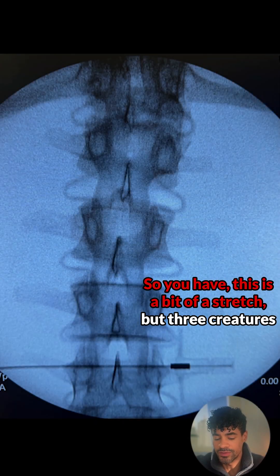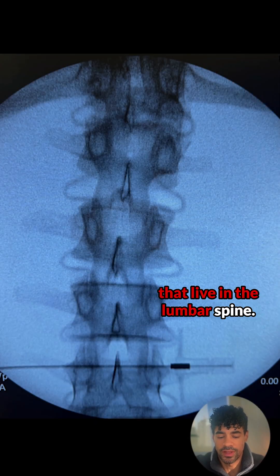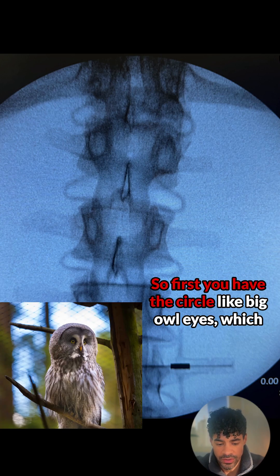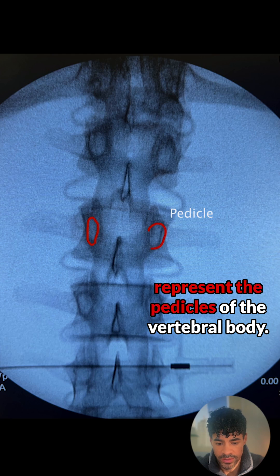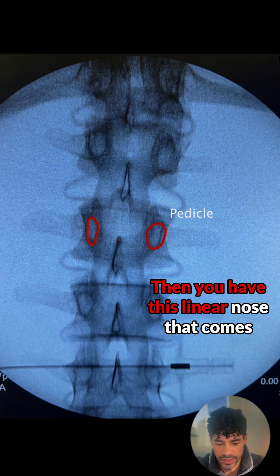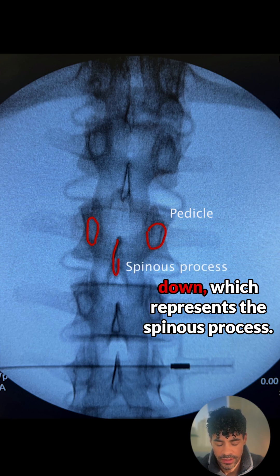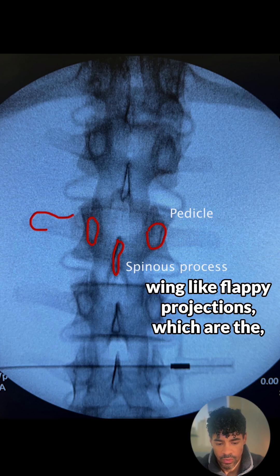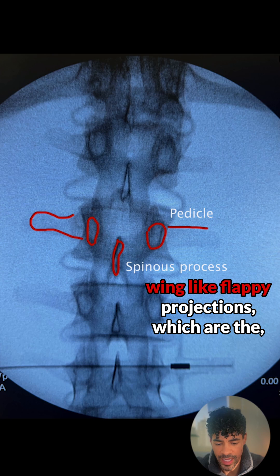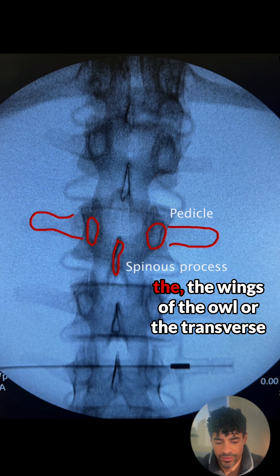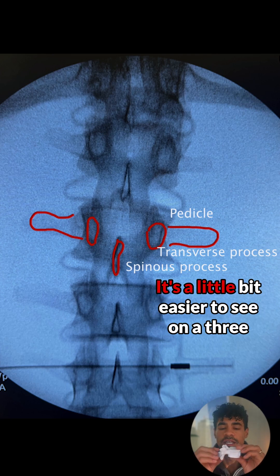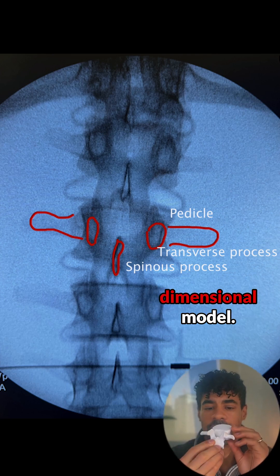This is a bit of a stretch, but there are three creatures that live in the lumbar spine. The first is an owl. You have these circle-like big owl eyes, which represent the pedicles of the vertebral body. Then you have this linear nose that comes down, which represents the spinous process. Then you have these wing-like flappy projections, which are the wings of the owl — or the transverse processes of the vertebral body. It's a little bit easier to see on a three-dimensional model.